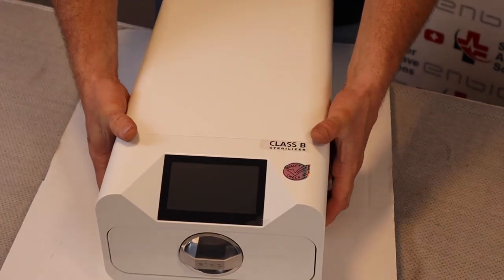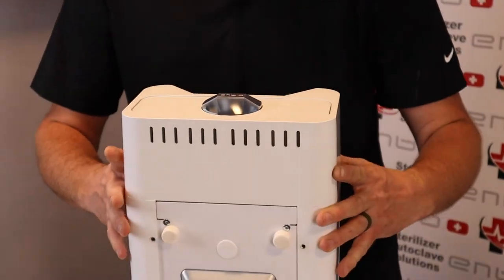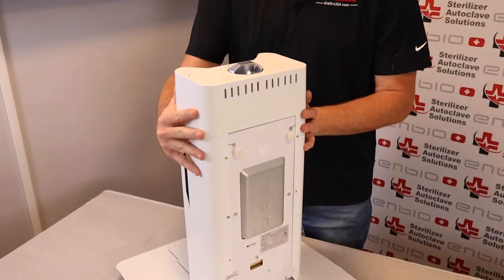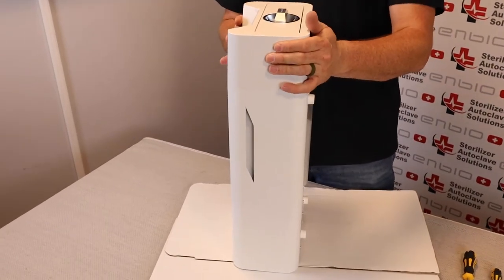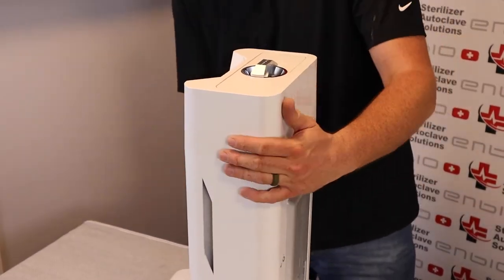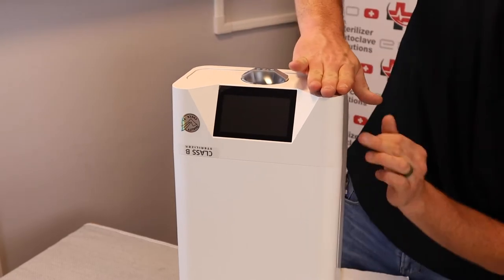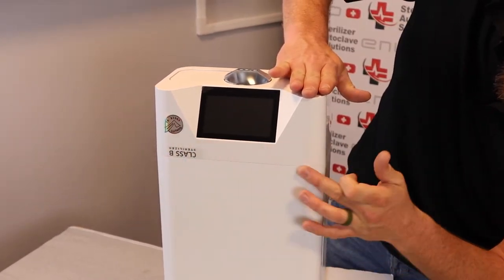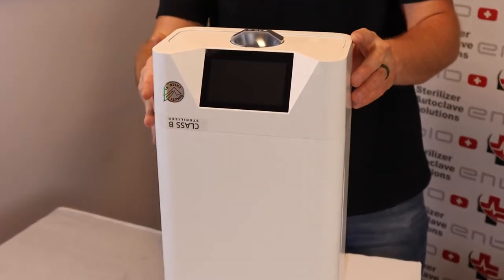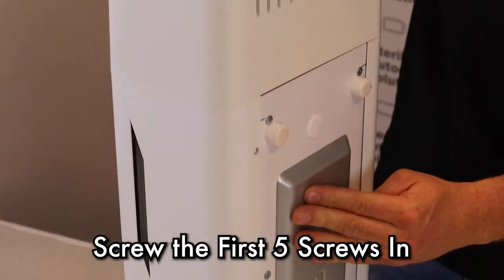Once this is on, what we're going to do is lift the whole unit. Our front fascia is still loose from a previous repair. So what we are looking for is a proper seal and no gap anywhere around. You have six screws that hold these on.